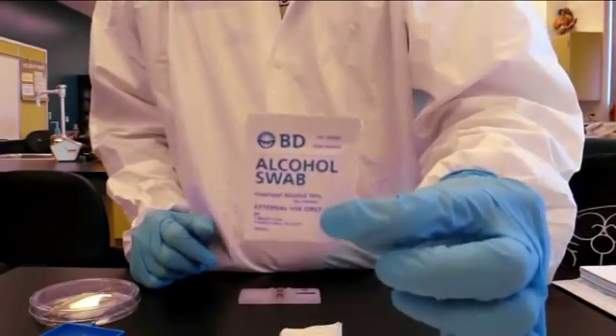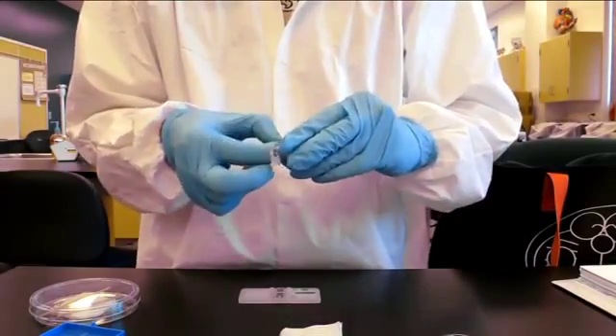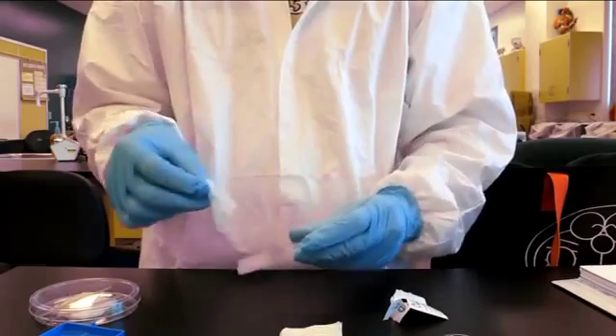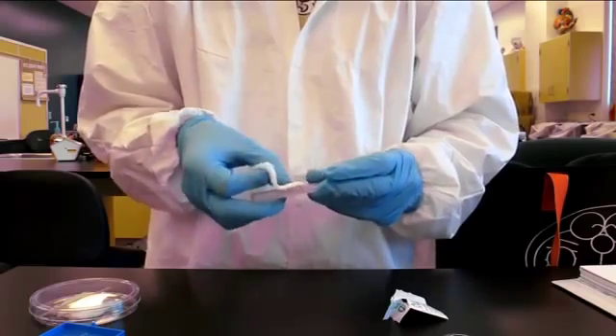The hemocytometer and the cover glass should be cleaned first using an alcohol swab. It should be dried using only a cotton gauze, otherwise the glass will get scratched.